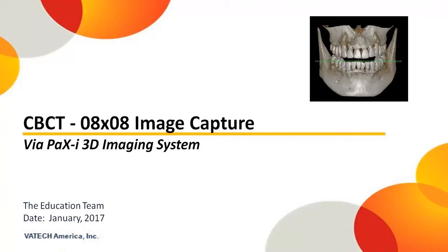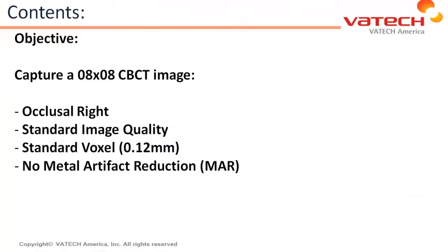CBCT 8x8 image capture via the PAX-I 3D imaging system. Objectives are to capture an 8x8 CBCT image, occlusal right, standard image quality, standard voxel of 0.12 mm with no metal artifact reduction.